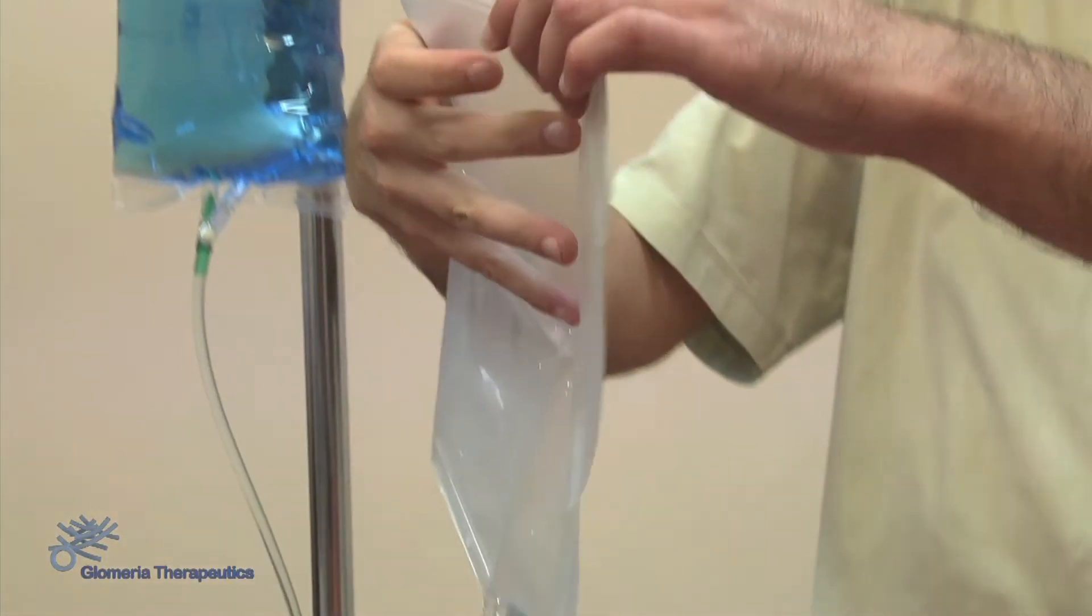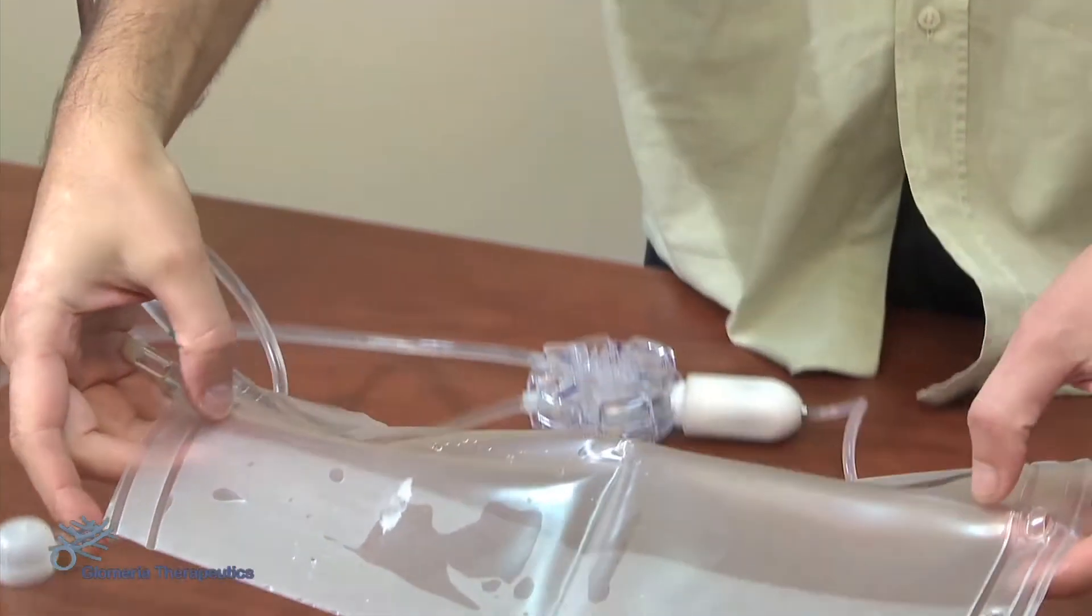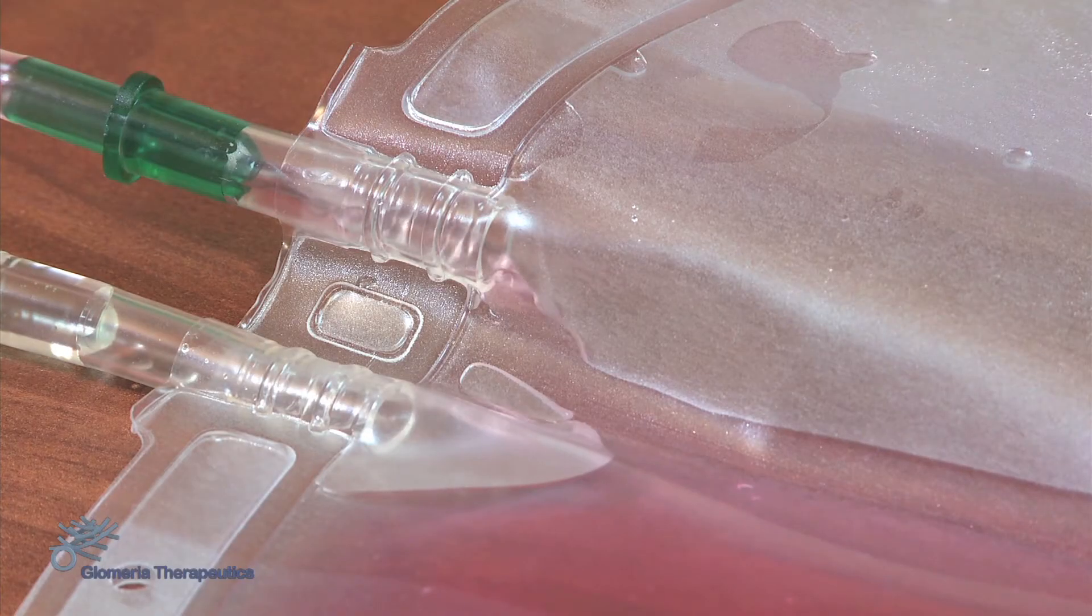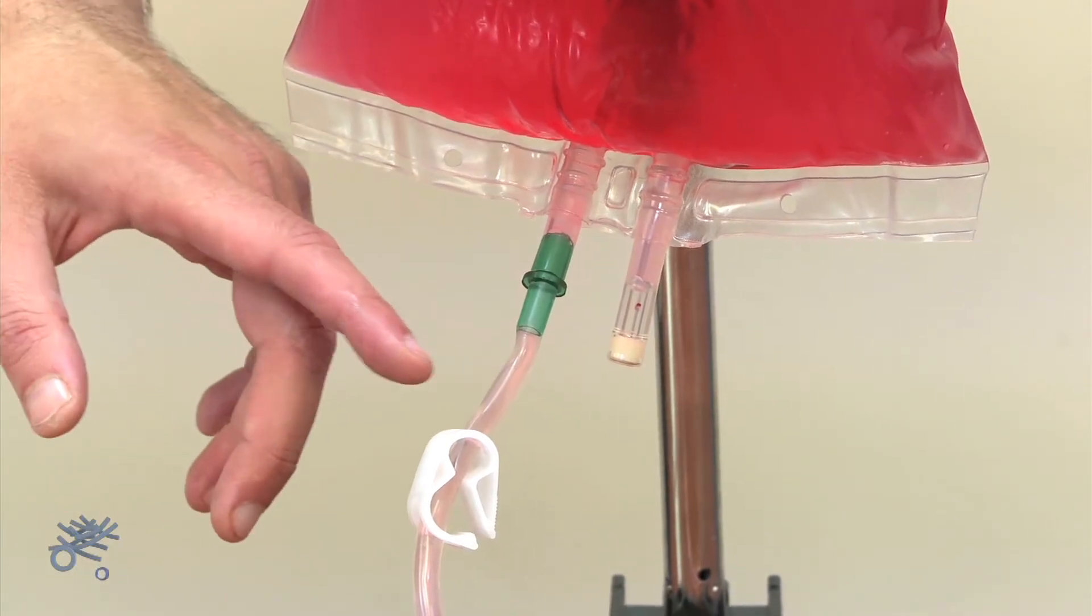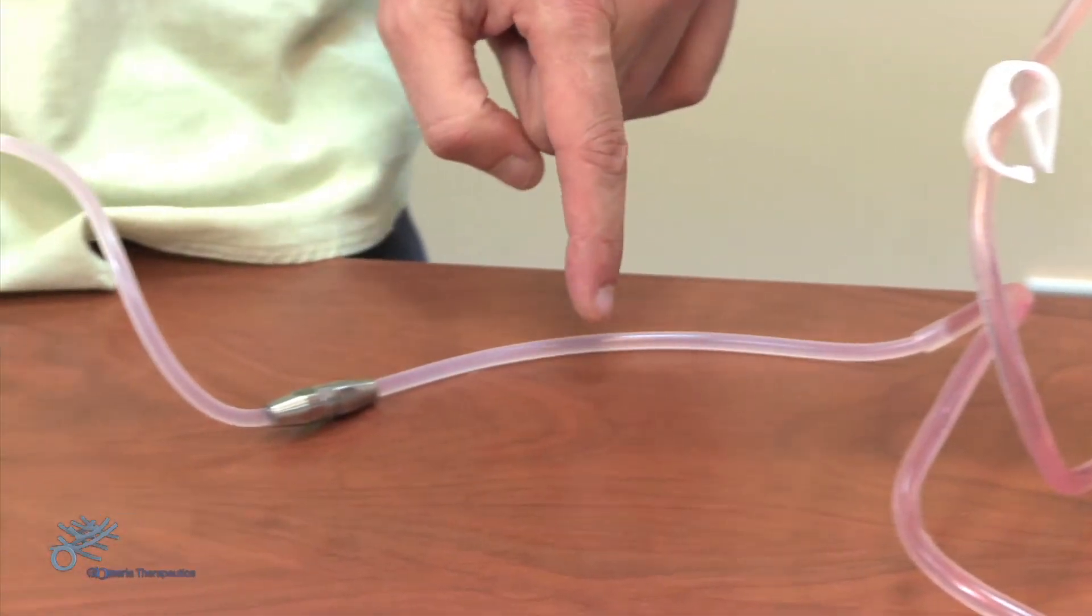We now unhook the empty bag and place it on the floor. The red-colored liquid in the bag, which simulates the peritoneum, flows towards the receptacle bag, filling it.